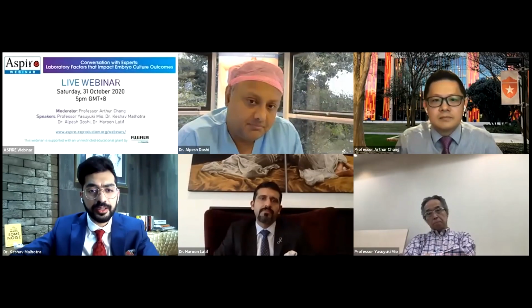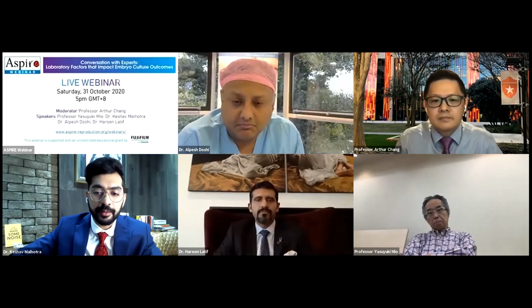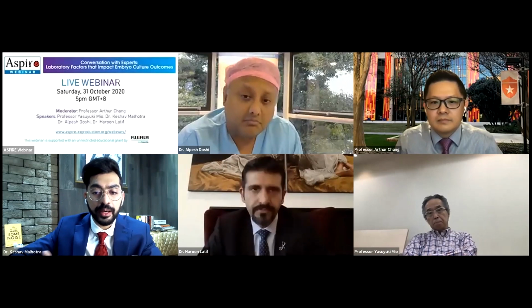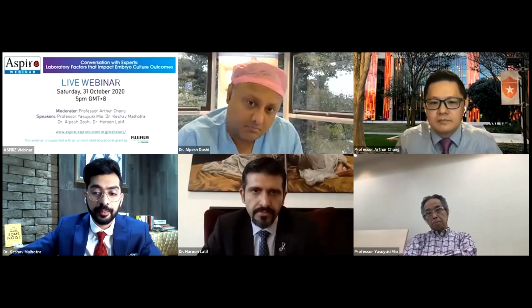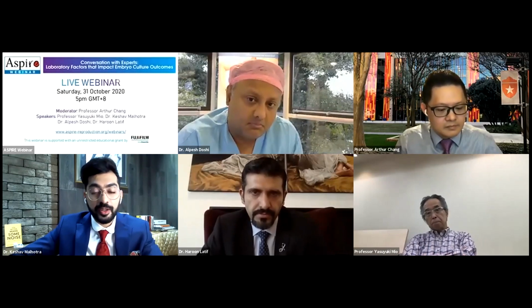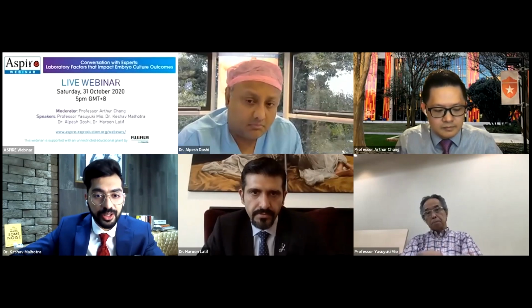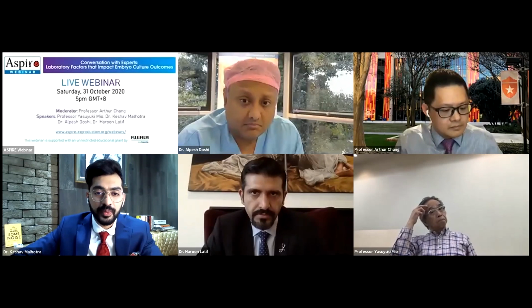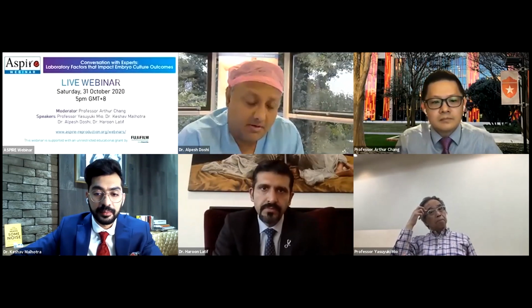And even for cryopreservation, Alpesh, I feel that if you have an expanded blastocyst, it might survive much better. Also, you'll have a better assessment of the trophectoderm and of the ICM. And maybe if it's not great, if it's a C grade, then the decision might also change. So I would prefer waiting instead of just freezing an early blastocyst. Agreed, yeah.